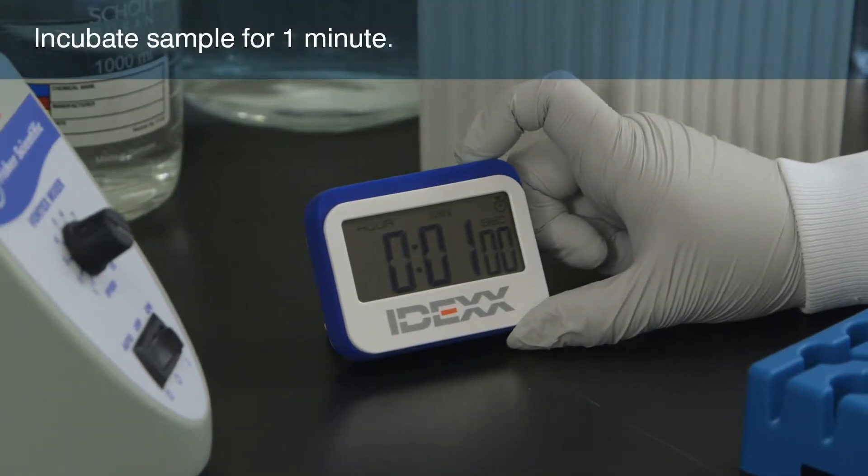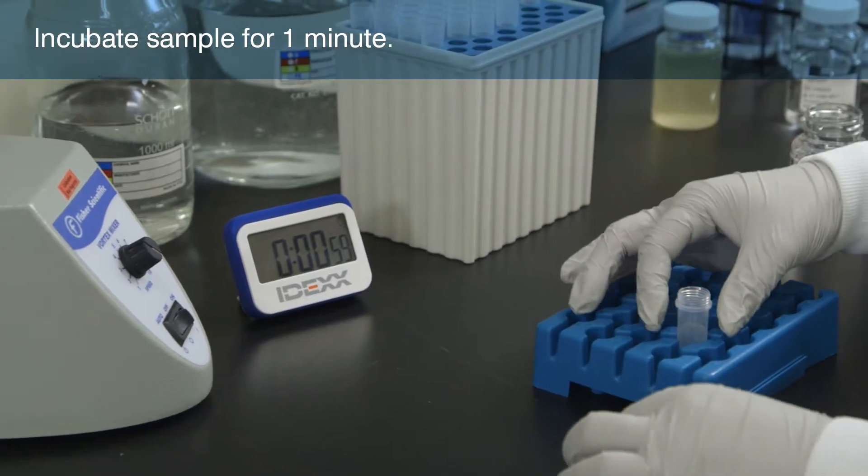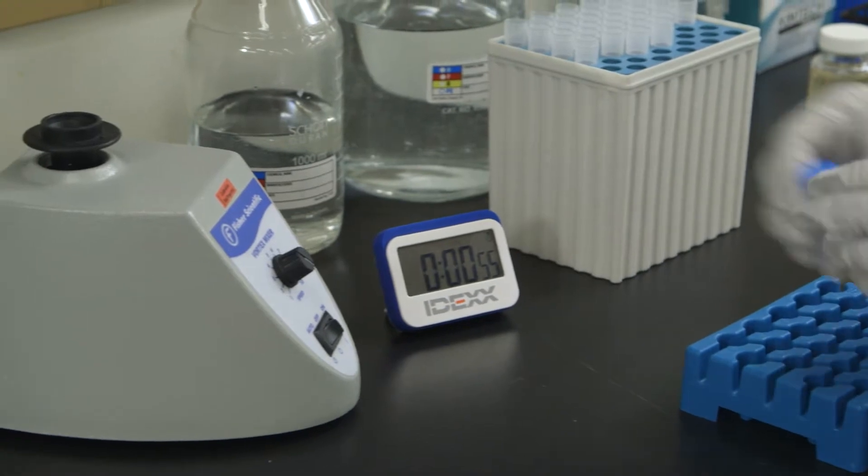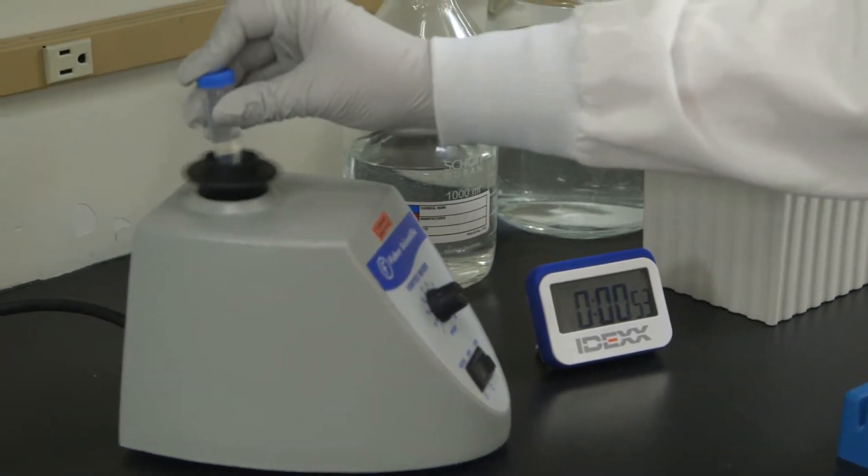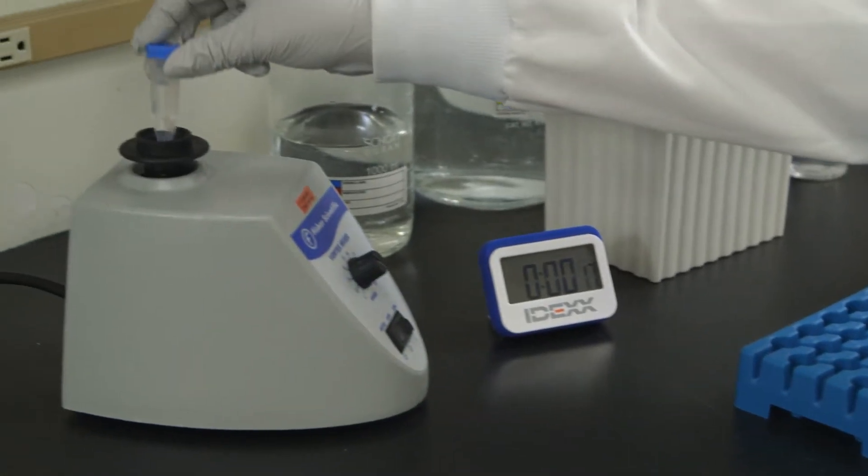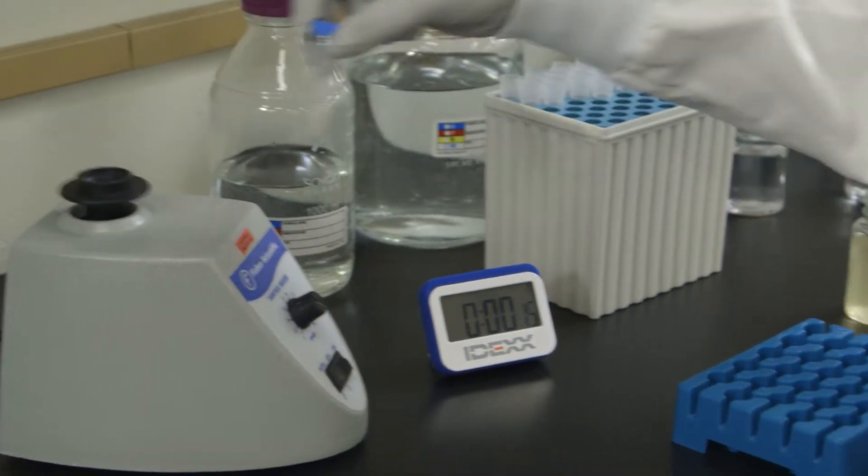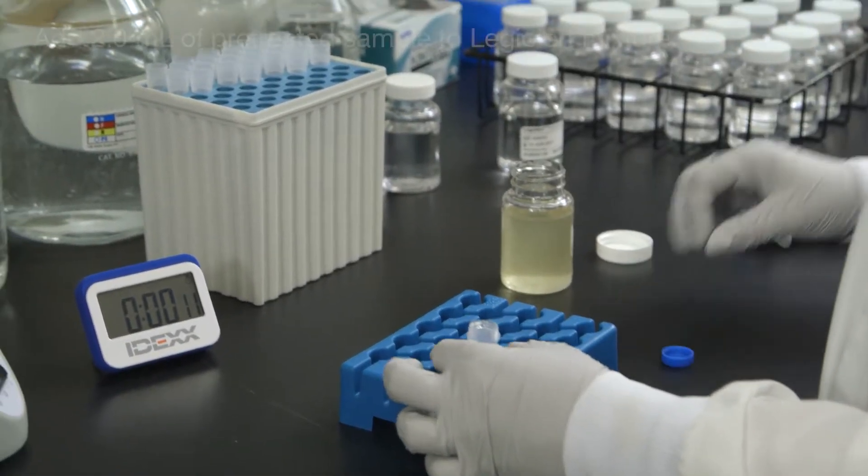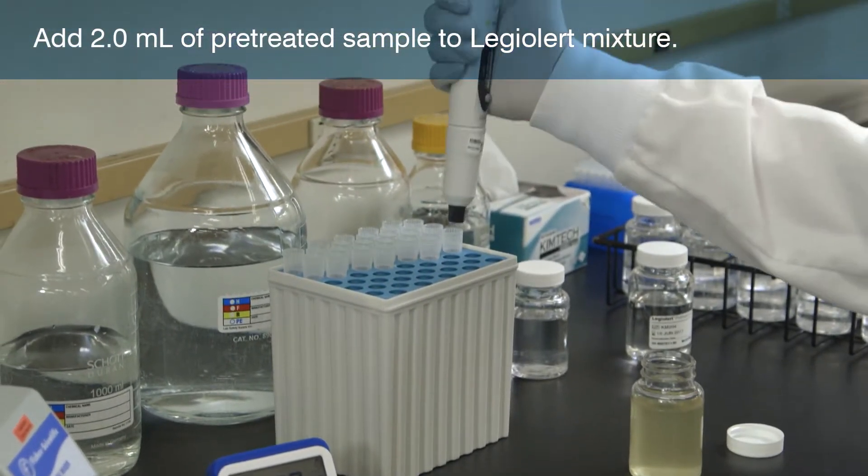Start a 1-minute timer and then mix the contents thoroughly. Mix again before the 1-minute is up. At 1 minute, immediately transfer 2 mL of the treated sample to the vessel containing the dissolved LEG-ALERT reagent.